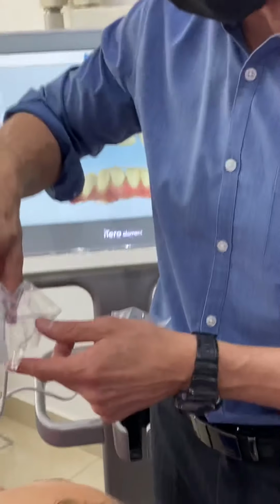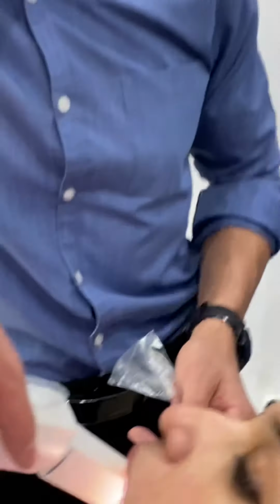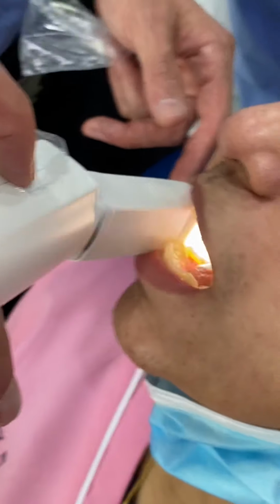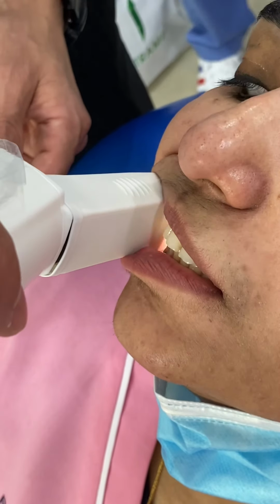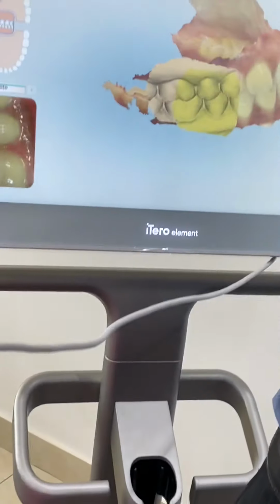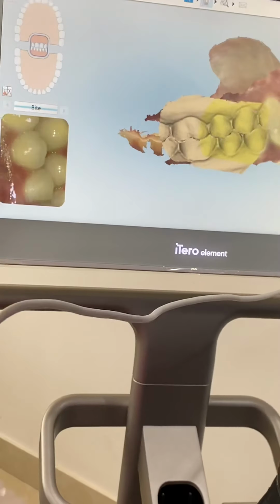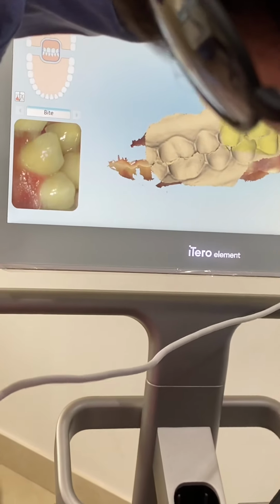Okay, can you open your mouth? To push it. Close. Close all the way. Yep.